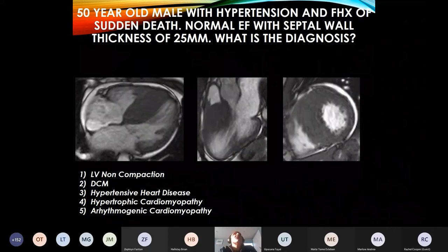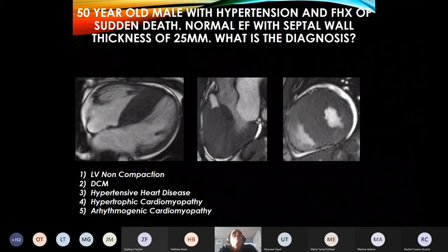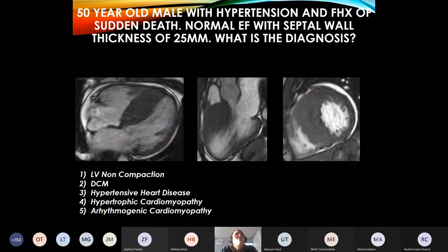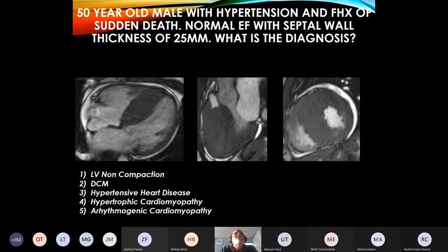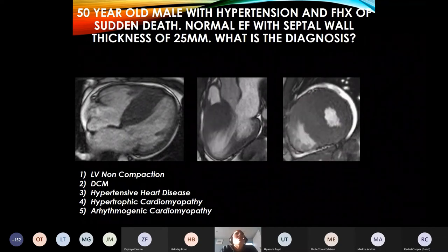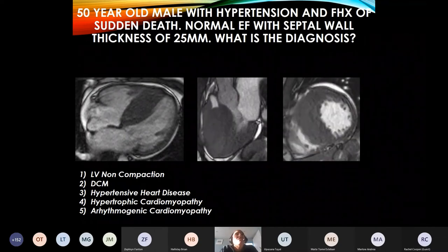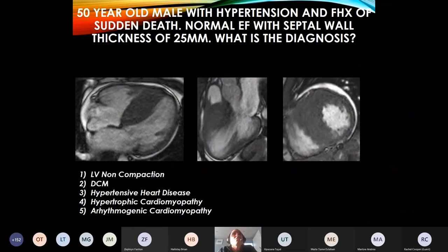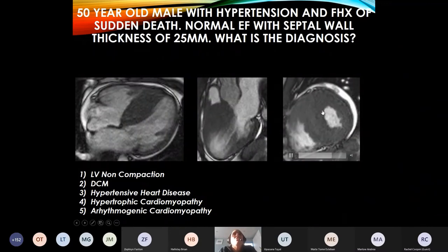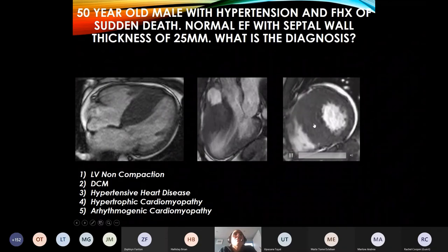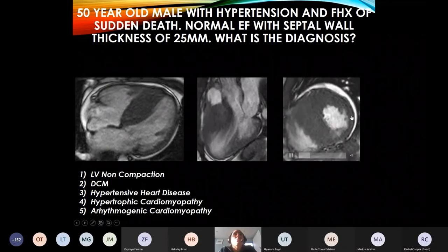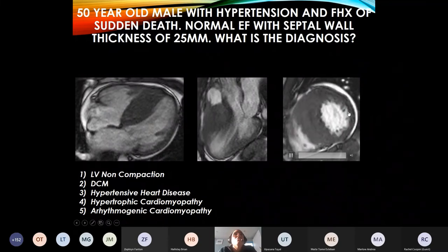And the last of the cardiomyopathies — a 50-year-old male with hypertension, family history of sudden death, normal ejection fraction. Wall thickness of 25 millimetres in the septum. This is classic hypertrophic cardiomyopathy — really gross asymmetrical septal hypertrophy. The septum here is really thick; look how thin the lateral wall is in comparison. Really impressive HCM.